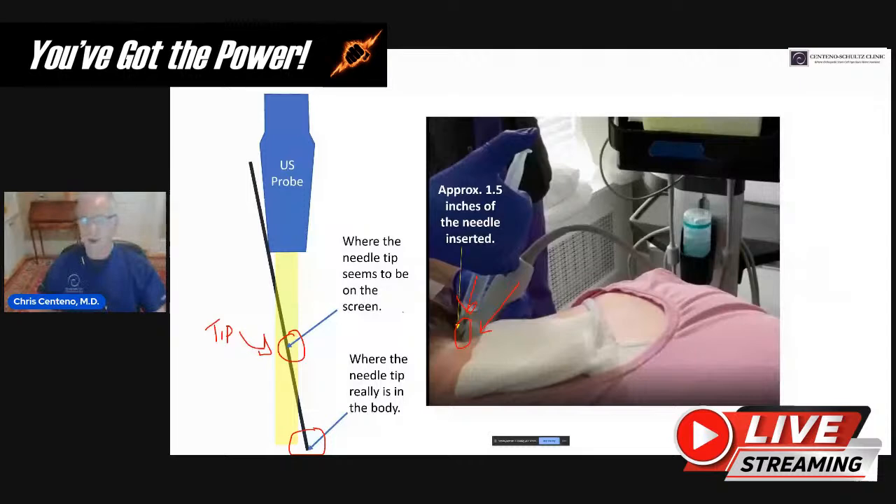This is a mistake I see fellows make all the time when I educate them on how to do short axis injections — they lose control of that needle tip. It's a rookie move. You don't want to make a rookie mistake in this part of the neck, because if you lose track of where that needle tip is and then you inject, you can cause a posterior circulation stroke or a high spinal cord injury.